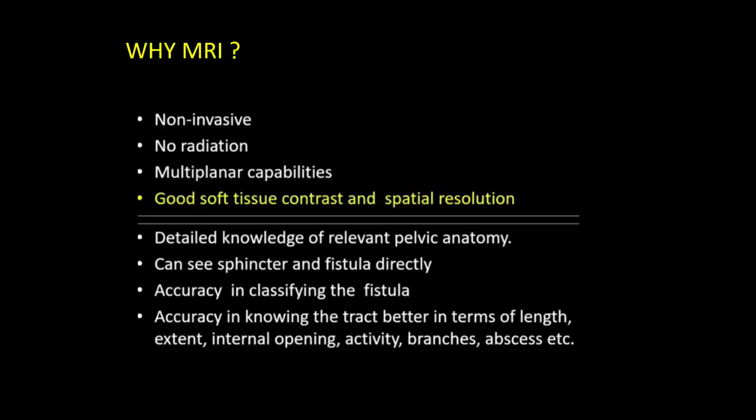Right. So why MRI? It is non-invasive, non-radiation, multiplanar capabilities, and of course, very good soft tissue contrast and spatial resolution. Detailed knowledge of relevant pelvic anatomy. You can see sphincters and fistulas directly, and accuracy in classifying the fistula. Accuracy in knowing the tract better in terms of what is the length of the fistula, where is the internal opening, where is the external opening, what is the activity, whether it is acute, subacute, chronic, branching or ramifications, or any associated abscess.